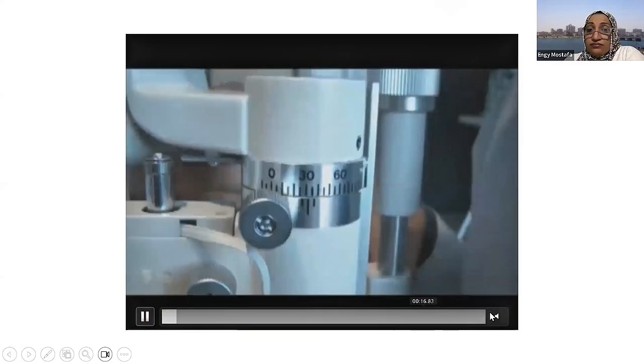The final one we are looking at is the specular illumination. The specular illumination has a story behind it, actually. The angle of incidence has to equal the angle of reflection. It depends on the normal reflection law. Like if you want to see the reflection in a mirror, the angle of incidence should be equal to the angle of reflection.